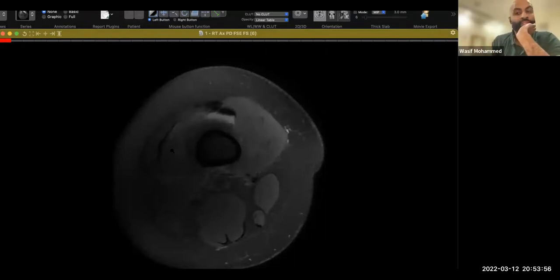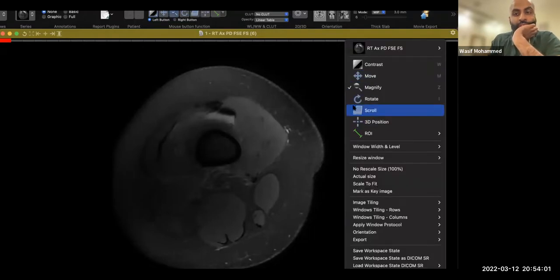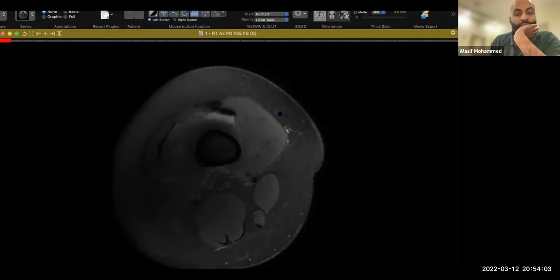So your next case, I'll just switch this to scroll one second. Okay, so now you can take.